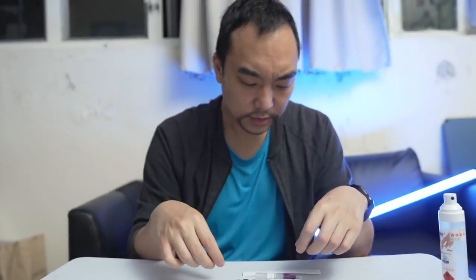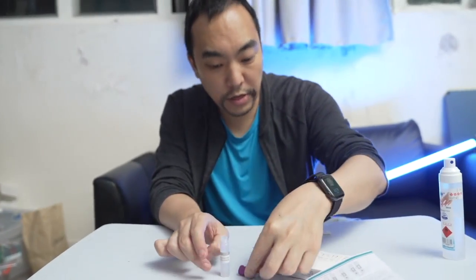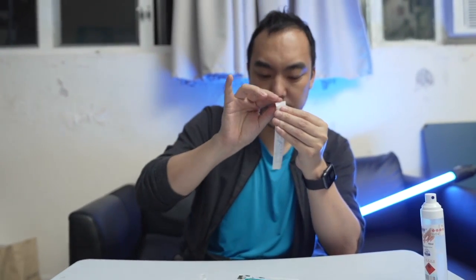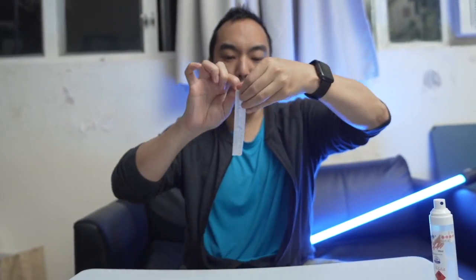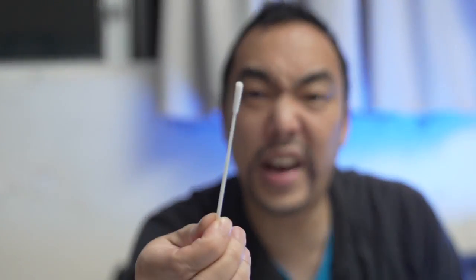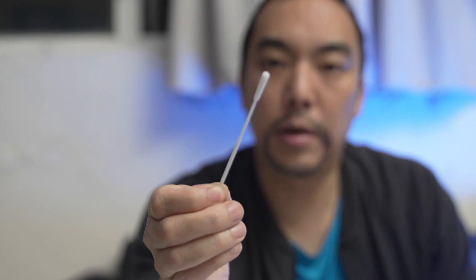Yeah. So first thing is you get this liquid and you open the bottle. And then you get this thing and you shove it up your nose. What a test. So I'm going to open it and I'm going to try not to contaminate it. Just touch this end. And on the other hand, it's like one of those Q-tips that you're not supposed to stick in your ears, but everyone does it. But that's what it is.